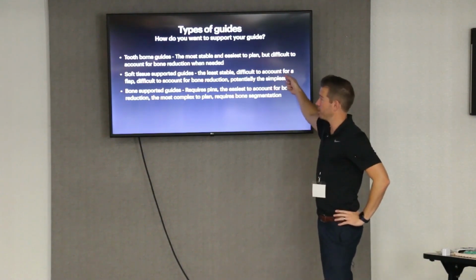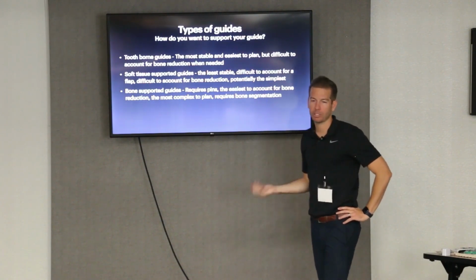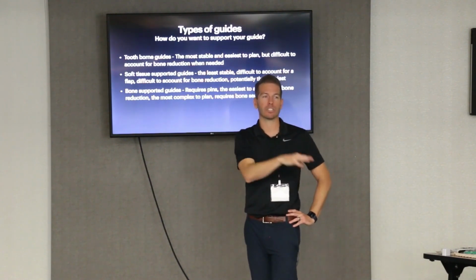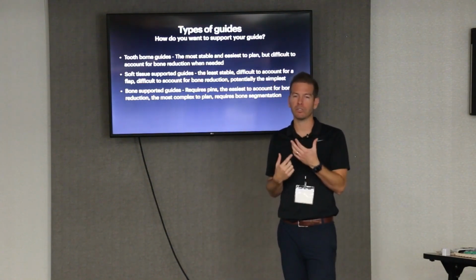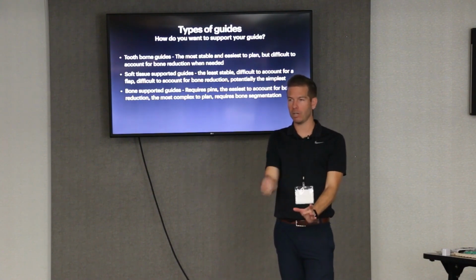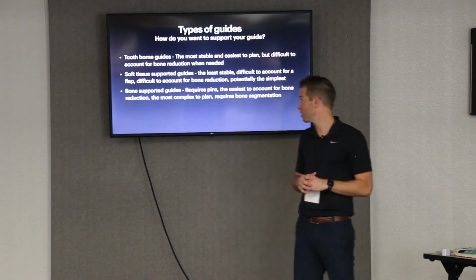If they were edentulous and they came in with a denture, and they want implants placed for an overdenture, or implants placed for a fixed restoration, you can just scan that denture and convert it into a surgical guide. We did that before in one of our courses, but it's soft tissue supported. Maybe you just hold the guide and drill your implants. Maybe you put some pins in there to support it. Lots of different ways to do that.